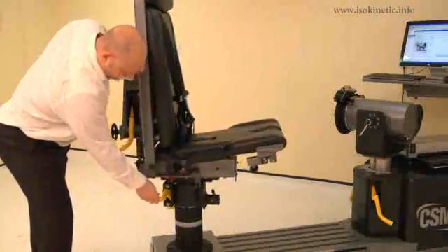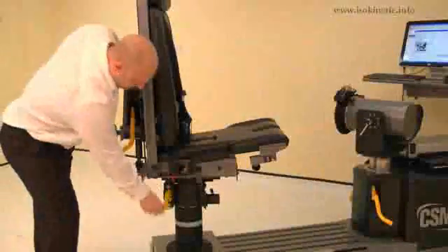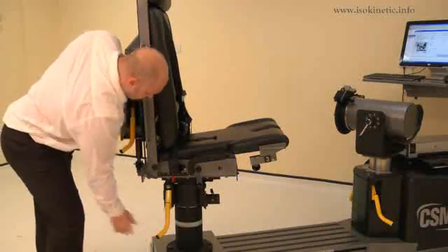Lift the locking handle and rotate the chair. Rotate the chair to 35 degrees on the black scale. Ensure both locking handles are pushed down to secure.